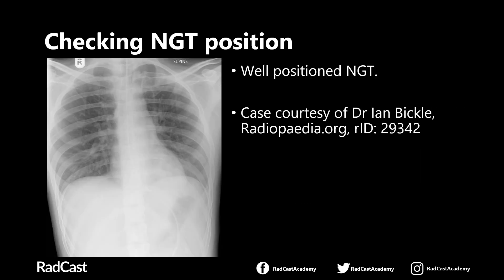Here we have a good example of a well-positioned nasogastric tube. Going through the checklist, you can say yes to each of the five points. The tube starts off in the midline passing vertically. When it reaches the carina, it doesn't follow the course of either the right or the left main bronchus — it bisects the carina and continues more or less in the midline until it deviates towards the left at the gastroesophageal junction, goes left into the stomach, and the tip is located within the stomach at least 10cm away from the gastroesophageal junction. This nasogastric tube is in a good position and safe to use.